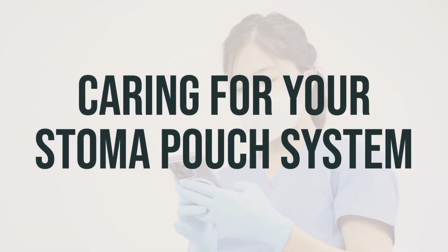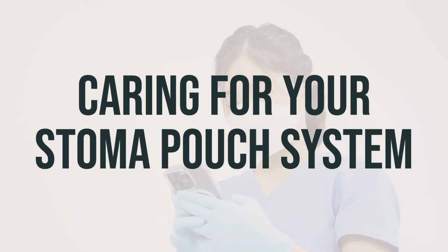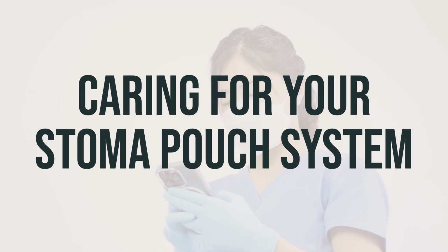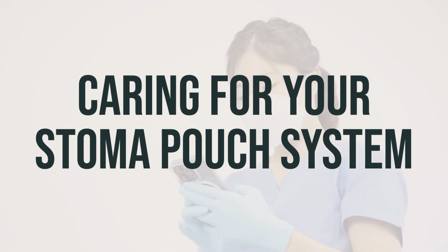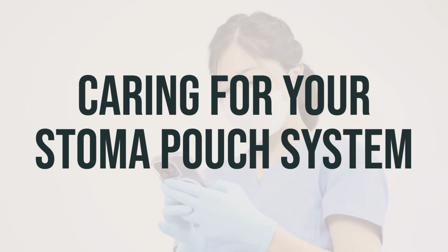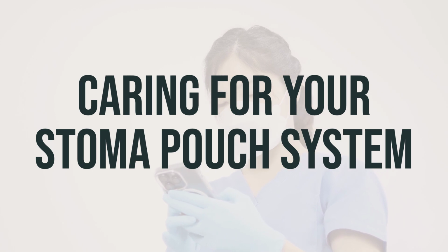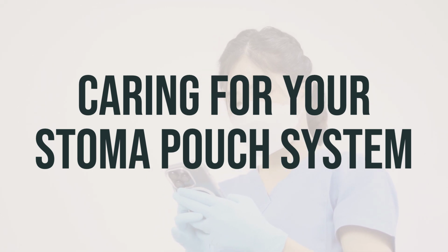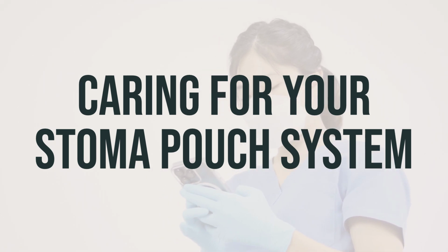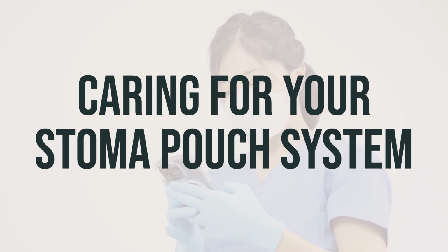When it comes to caring for your stoma pouch system, there are a few things to keep in mind. First, your healthcare team will help you choose the best system for your body and its needs. There are two main types, one-part and two-part systems. With a two-part system, you'll have a pouch and a skin barrier that attaches and detaches from the pouch. This allows for easier changes. With a one-part system, the pouch and barrier stay connected.